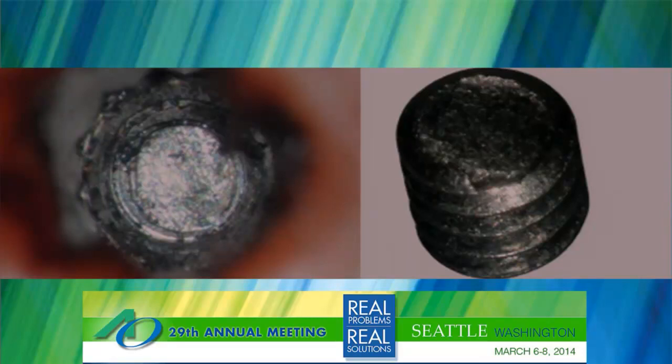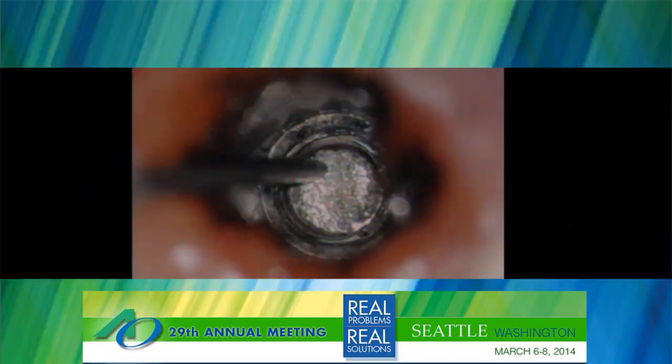Remember, the images taken under the scope are coming off a mirror so that they're actually reversed. So when you're trying to back a screw out, it looks like you're screwing it down, but actually it's coming up because it's a reverse image off the mirror. So here's an endodontic explorer. That's all I'm using at this point to try to recover this screw. Very simple. There's another little trick that's oil of wintergreen. A mechanical engineer in San Diego told me about this several years ago. It's a very lightweight organic lubricant, and it helps break up some of the possible biofilms that might be in there and decrease the friction going out.